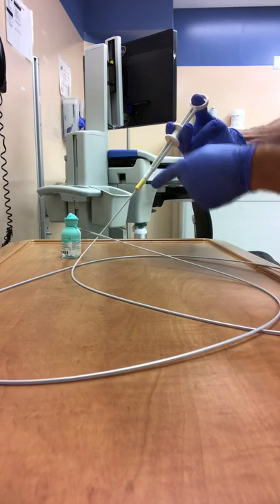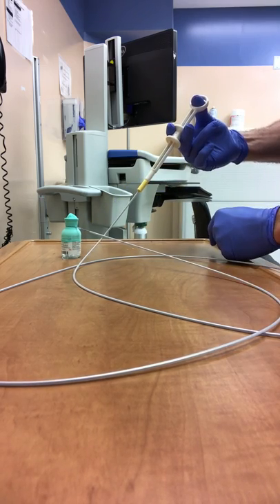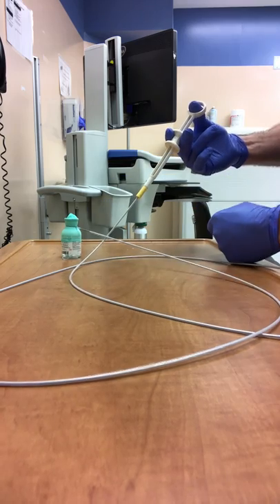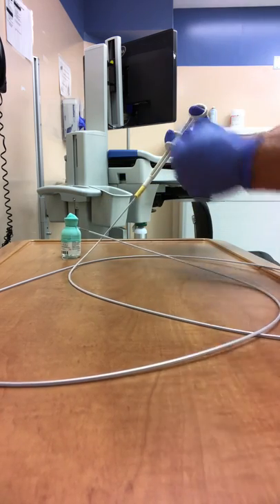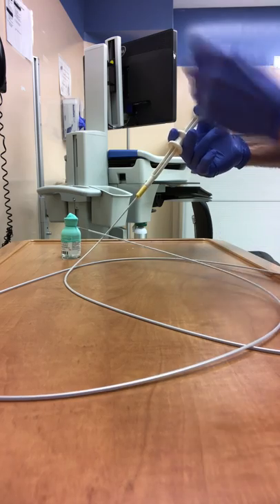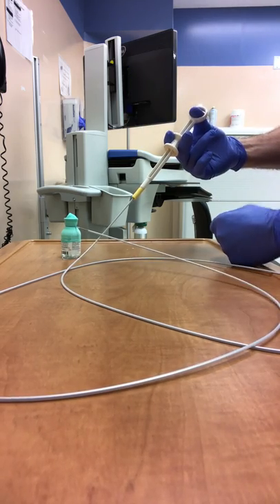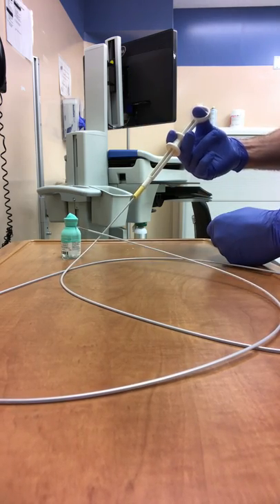Once that metal catheter is showing and the yellow tab and the handle are touching, you now simply tighten this until your desired tension in order to achieve hemostasis around the stalk of that polyp. The polyp head should turn purple and change color and you realize that hemostasis has been achieved.